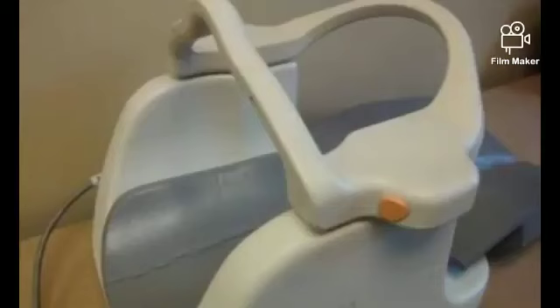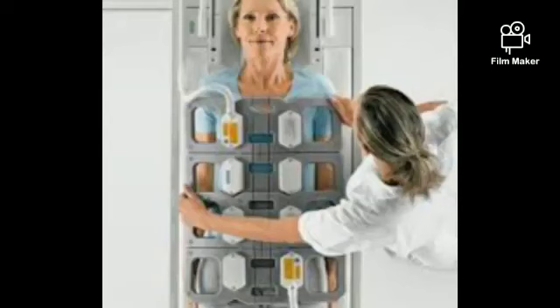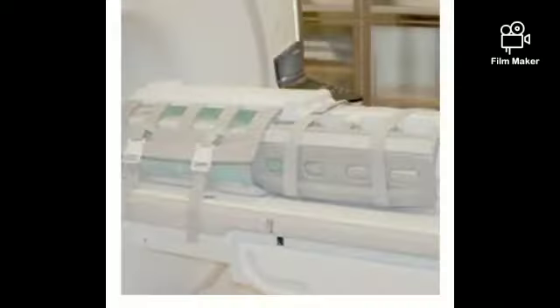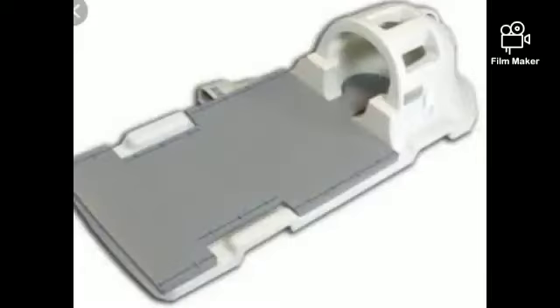This is the neurovascular array coil, and this is a spine coil for spinal studies. This is the body flex coil used for MRCP and abdomen studies. It has two parts, both an anterior coil and a posterior coil. So when we are doing the study, we have to place both the anterior and posterior coil, and this is the image of whole body MRI. We have to place all the coils when doing MRI thoracic as well as MRI abdomen. So for thoracic and abdomen collectively you have to use all these coils, and additionally for whole body you have to place the coils like this.